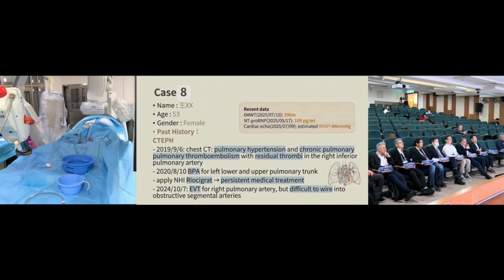We just did the pulmonary angiography and found a total occlusive lesion, I think a right A1 lesion, and there are also some other stenotic lesions. As you can see on the screen, the vessels are very tortuous, and there are signs of neovascularization.